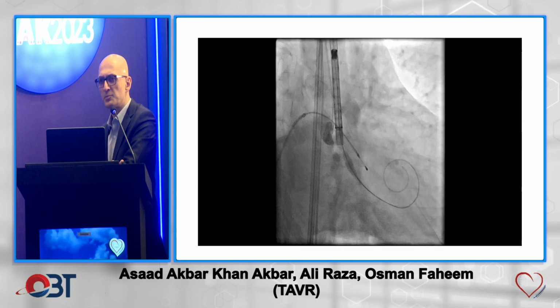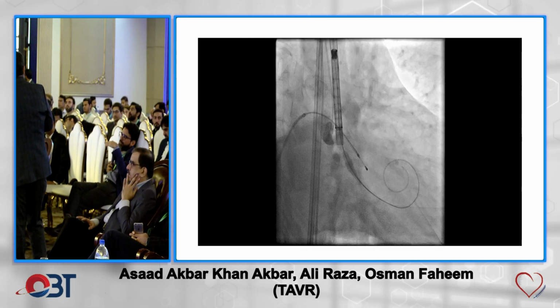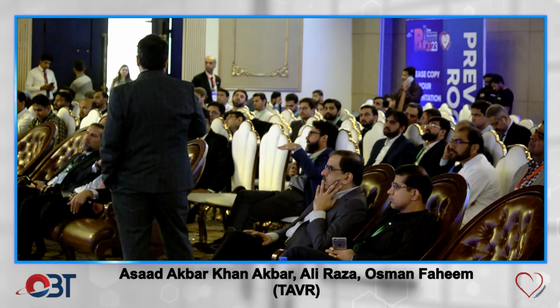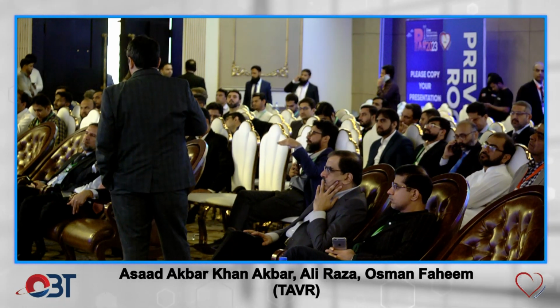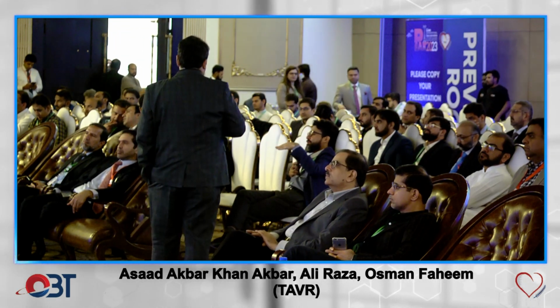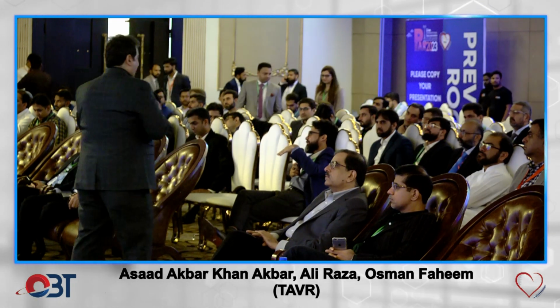So typically, if it's tricuspids, I would start releasing the valve when we're at the midpoint of the pigtail, because that brings your sheath right at the annulus. You look at the valve inside and you look at the sheath. If you were to start with the valve at the annulus, you're going to go deep. So it's best to start at the midpoint of the pigtail and start releasing.